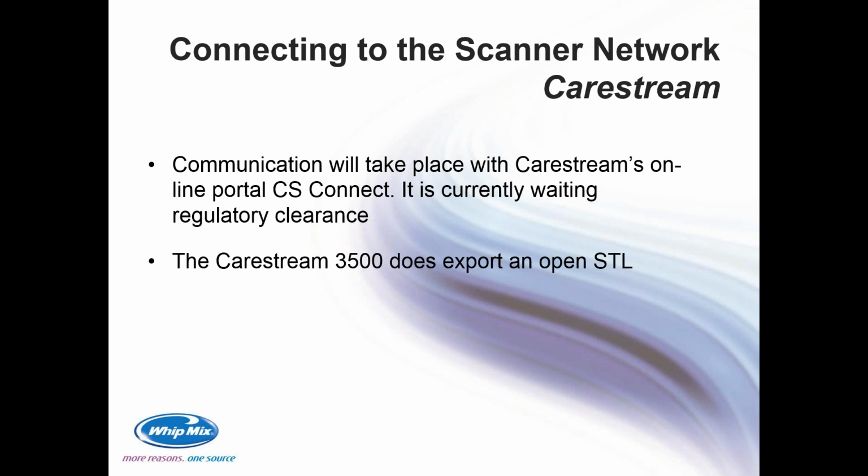The Carestream 3500 does export an OpenSTL, so once again, you can use DDX if you have problems, or if you're running into issues receiving an STL file. DDX seems to clean up a lot of problems between the communication files for these open STL files.